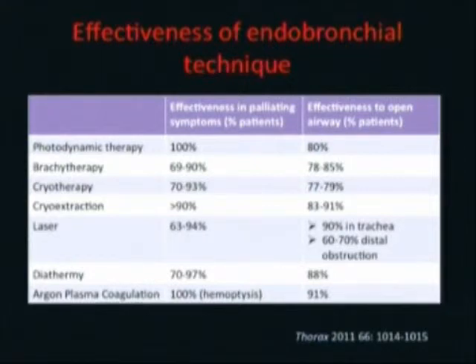So basically, to summarize the different therapies applied in the bronchus, you have photodynamic therapy. We're not going to discuss it today, but it's effective in palliating symptoms, is very expensive, and is effective in opening the airway. Then brachytherapy, cryotherapy, cryo-extraction, laser, diathermy, and argon plasma coagulation.